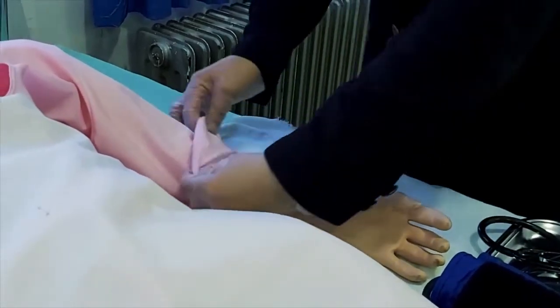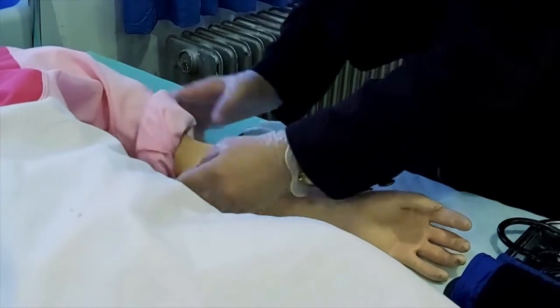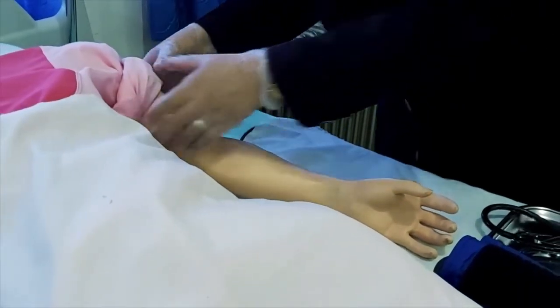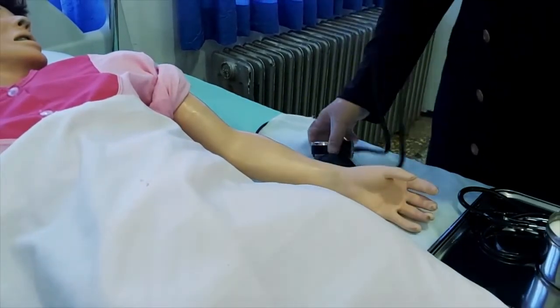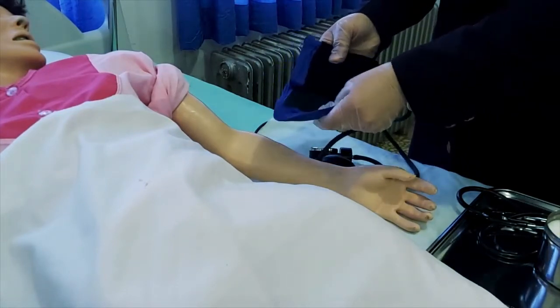آستین لباس دست مورد نظر را تا بالای بازو می‌زنیم. دست بیمار را طوری قرار می‌دهیم که ساعد هم‌سطح قلب باشد، کف دست رو به بالا. کاف فشارسنج را متناسب با سن و جثه بیمار انتخاب می‌کنیم.